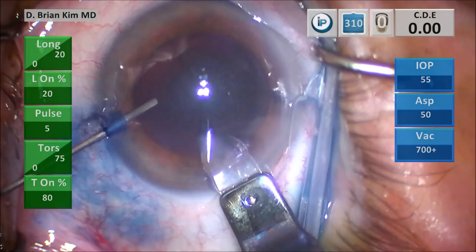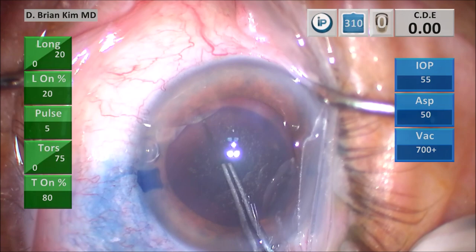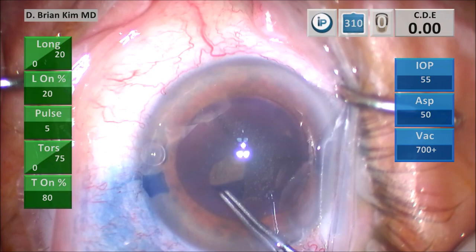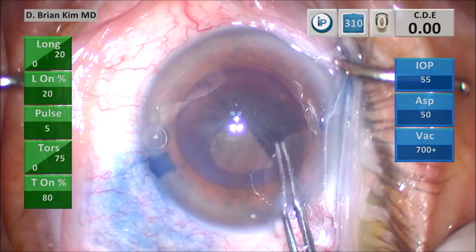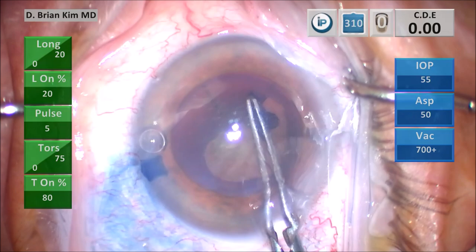This is my puncture-style capsulorhexis — I'm going to puncture the center. You can see there's a little bit of movement of the bag, which alerts me that there could be some zonular weakness, which is really not surprising in these cataracts. I usually anticipate weak zonules with these very dense lenses, and so routinely I like to put in a three-piece lens. I'm going around circumferentially grabbing and re-grabbing.